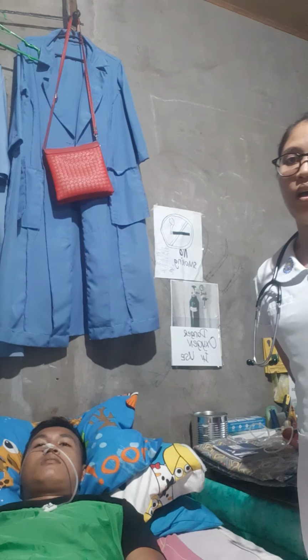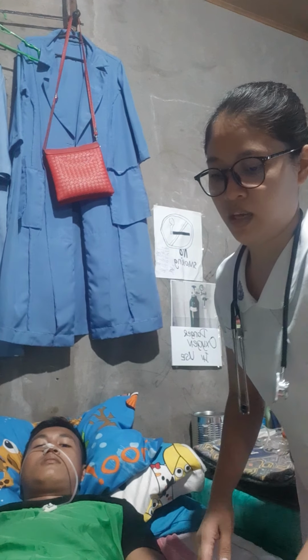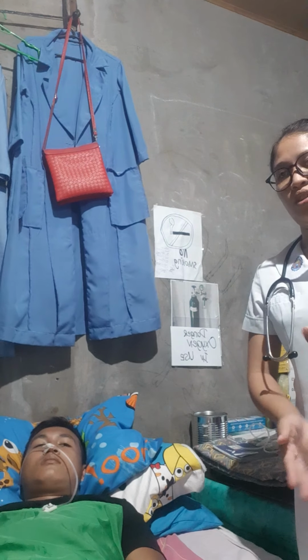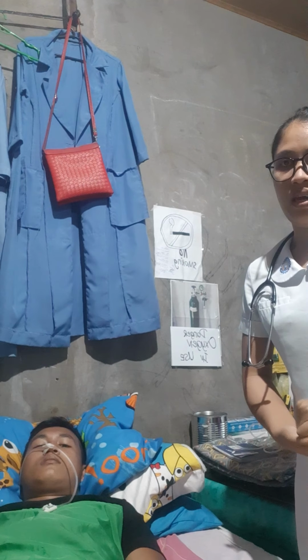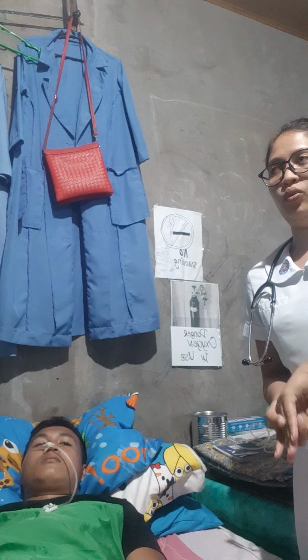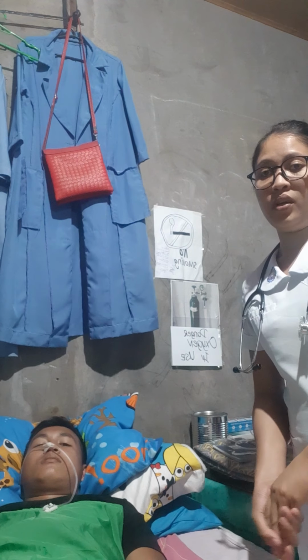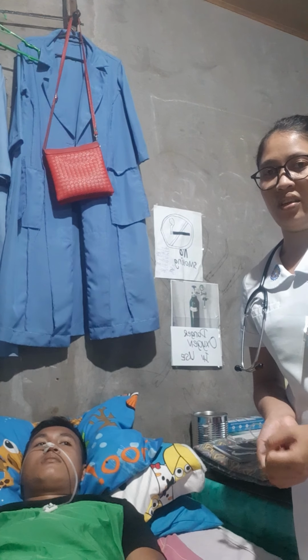So, next, perform hand hygiene and observe any other infection control procedures, and provide privacy for the client. So we need to close the curtain around the bed or close the door if applicable, because tube feeding is embarrassing.